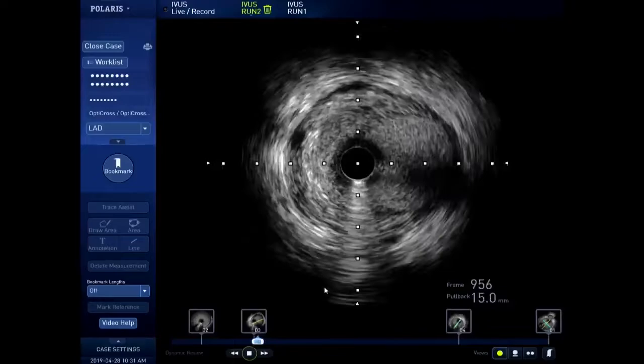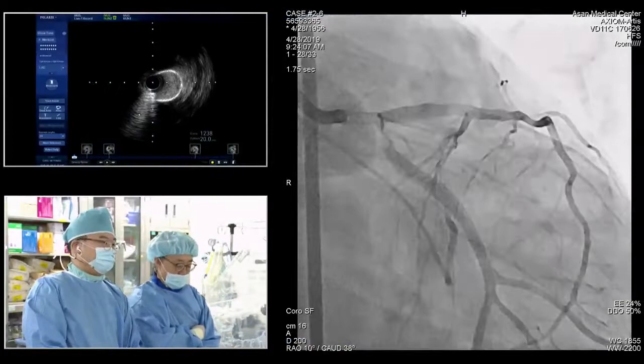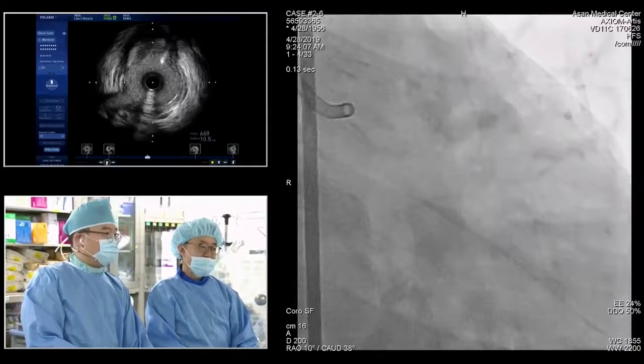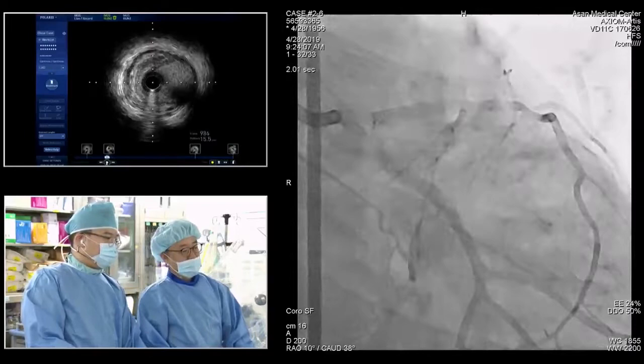Just a couple of quick comments. It's remarkable that the proximal LAD and the circumflex are essentially normal, but you also see that the left main disease extends into the LAD ostium and the circumflex ostium, which is typical of bifurcation disease. Yes. So this is an interesting case. I would call this Medina 1-0-1. I don't think there's much in the LAD. So I'd be very interested to hear how the panel would treat this, one stent versus two stents, and if one stent, stenting into the circumflex and provisional in the LAD. So SJ, maybe, and Marie-Claude, Adnan?